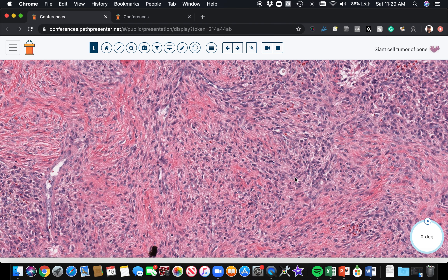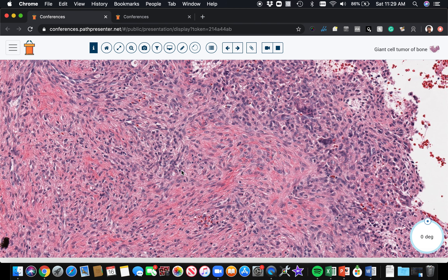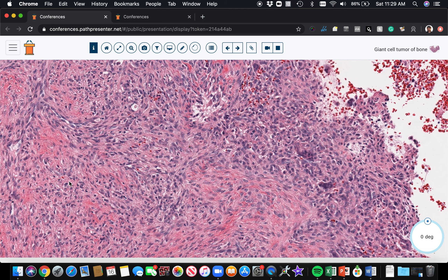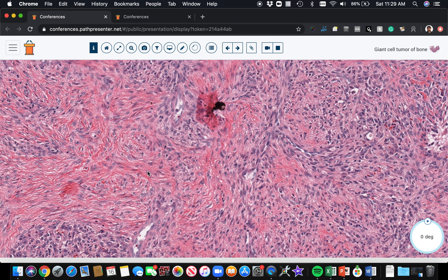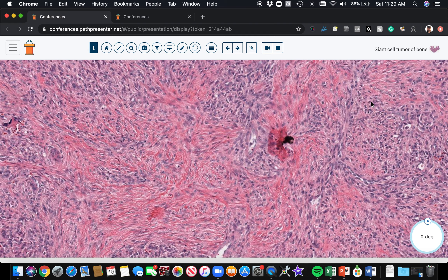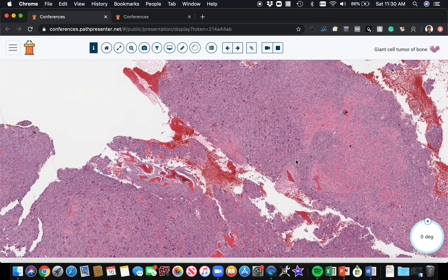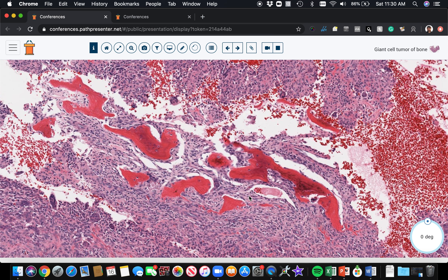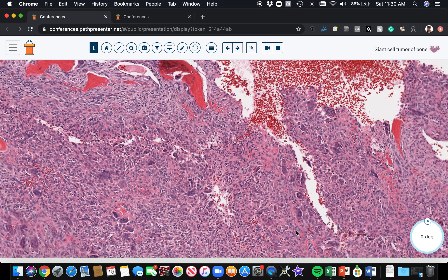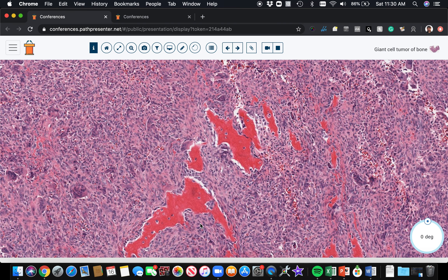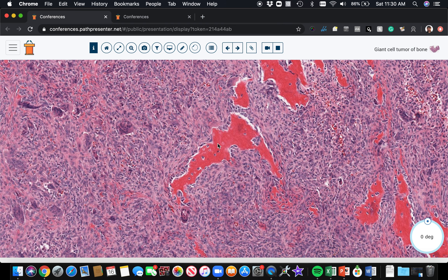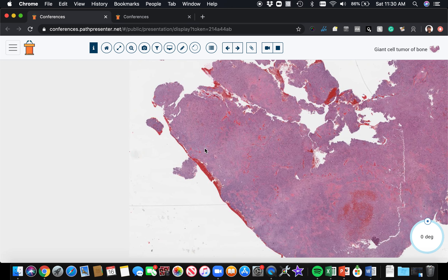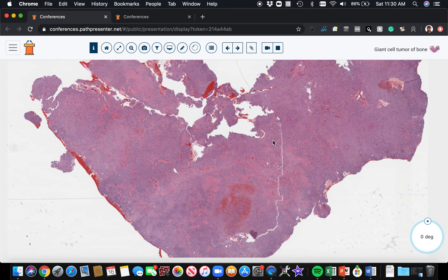Looking at this area, there are actually no giant cells in this field — but it's still giant cell tumor of bone. You have to put all the pieces together. Here's some more typical giant cell tumor that's becoming more streamy and spindled and fibrotic — this seems to happen more often adjacent to areas of secondary aneurysmal bone cyst change. Giant cell tumors sometimes make new bone, but in most cases it's not abundant. You can sometimes see little islands of new bone formation inside and around giant cell tumor, but classically there tends to not be very abundant new bone formation.